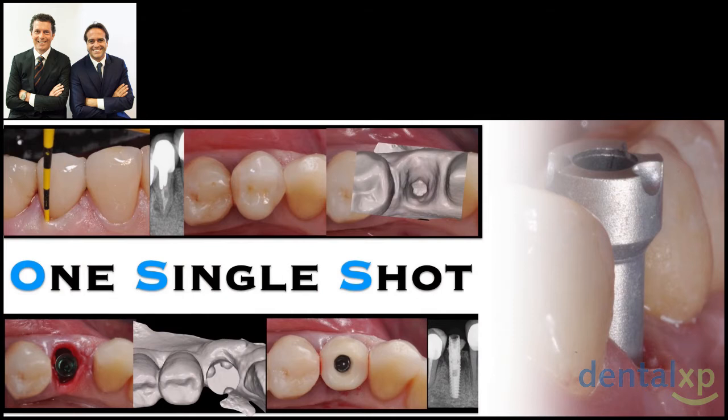And then we can also incorporate, also in this case, new working tools. So you see the digital dentistry is really a great tool that can be incorporated in our treatment plan, but the sequence of the corrective therapy is always given by the traditional background that each of us has. We can finalize this case in one single shot by taking the digital impression the same day of the implant placement.